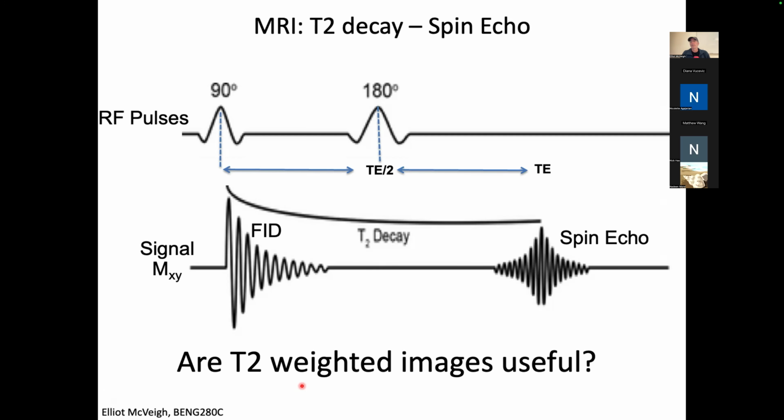So it went out of fashion for about 30 years to even measure these time constants. You just created images as quickly as you can with the best image quality that you can, and the T1 and the T2 participate in creating contrast, but you didn't really invert the signal to get the values.